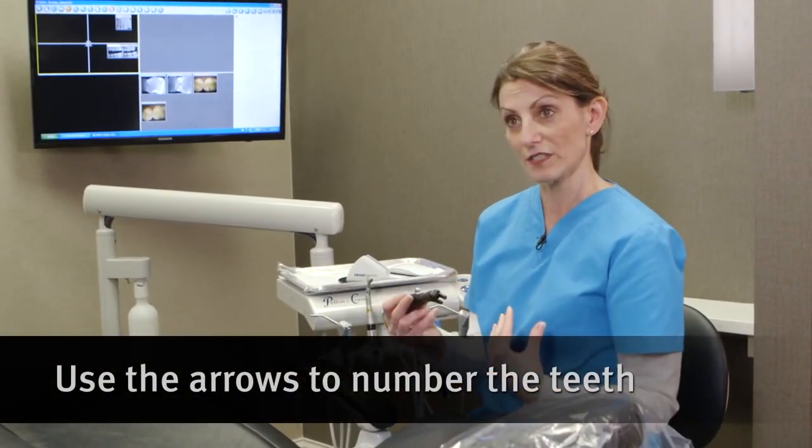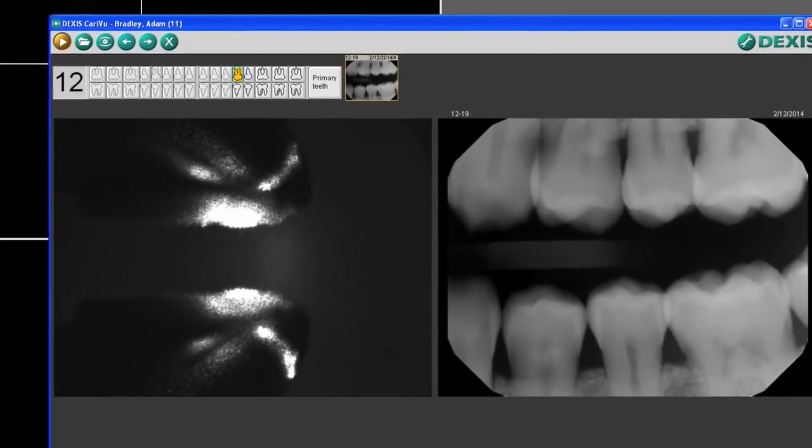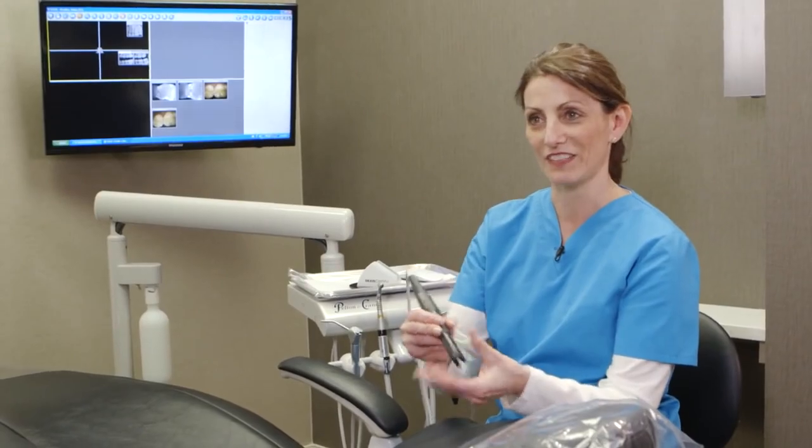It also has two arrow buttons to allow you to number the teeth. From a clinician standpoint, when I'm working on a patient I can easily navigate to number my images. You could also use the monitor and the mouse too — so if a doctor picked up the camera and was in an awkward situation, the assistant could easily grab the mouse and click it on screen.